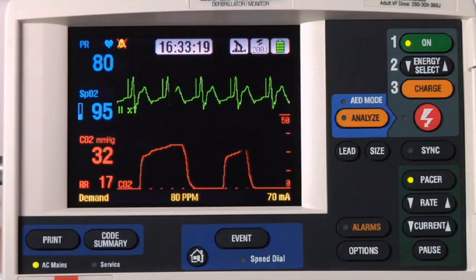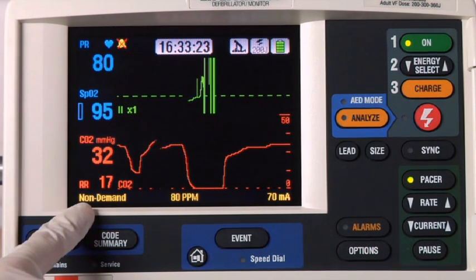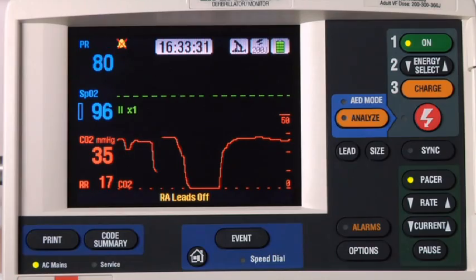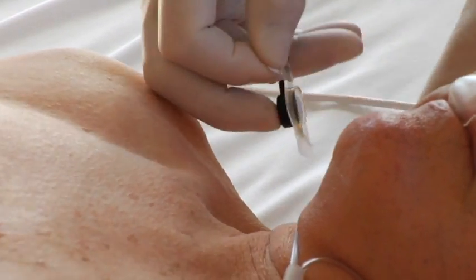If an ECG lead comes off, you'll lose sight of the rhythm. Pacing switches to non-demand or asynchronous mode, and pacing continues at 100% of the set rate regardless of the patient's underlying rhythm. To reestablish demand pacing, reattach the ECG electrode.